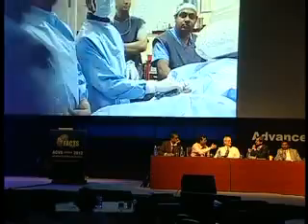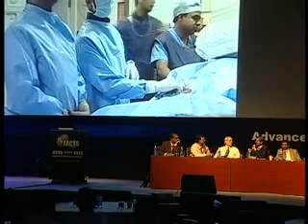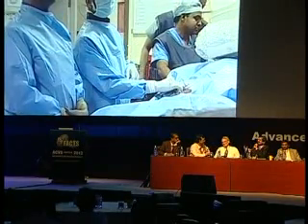Then it has to be treated like a native renal artery. Go up on the wattage. We would have stented only the ostial, but it should theoretically behave like a native renal artery. How much the wattage? But you can't deliver it through the stent with the same frequency. You cannot.